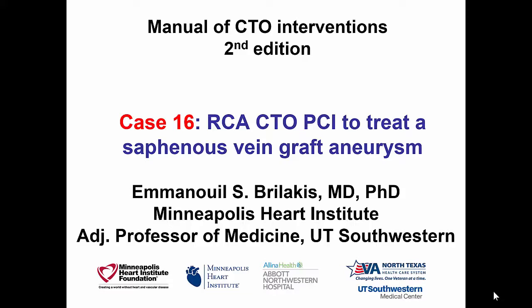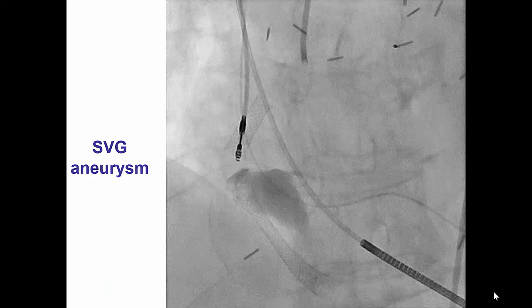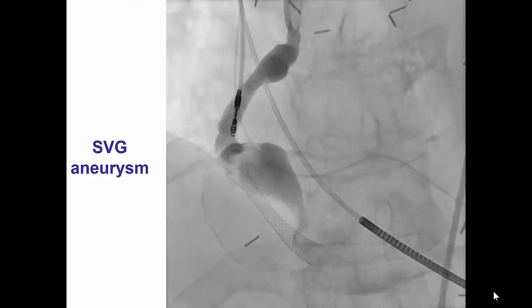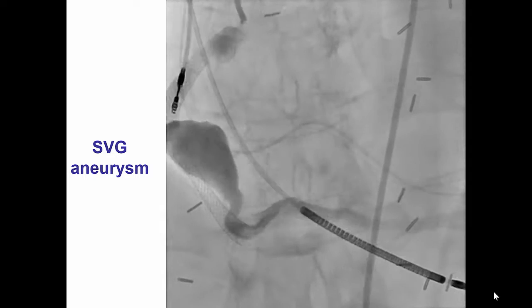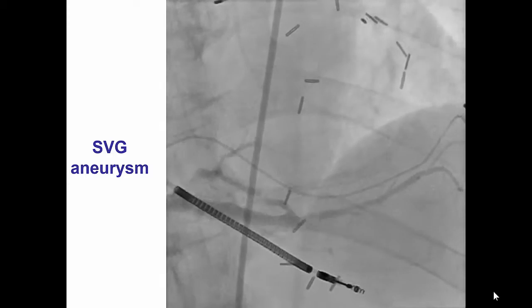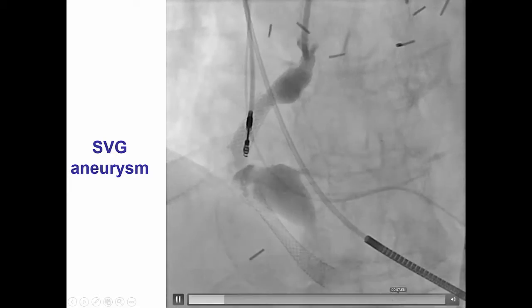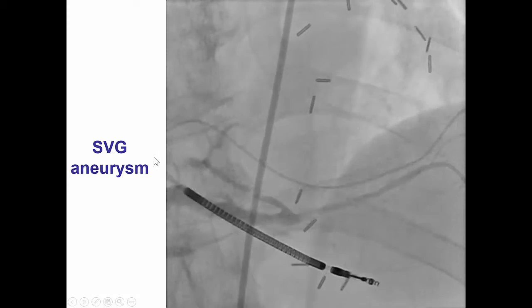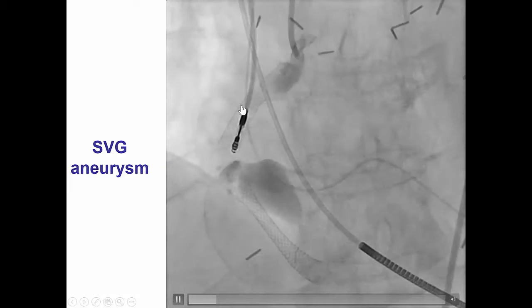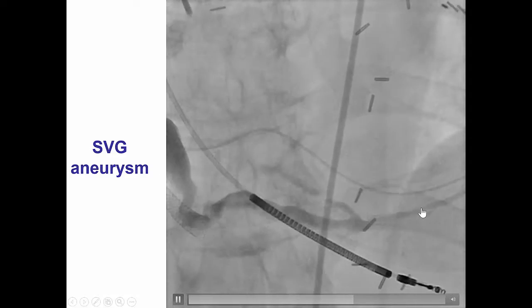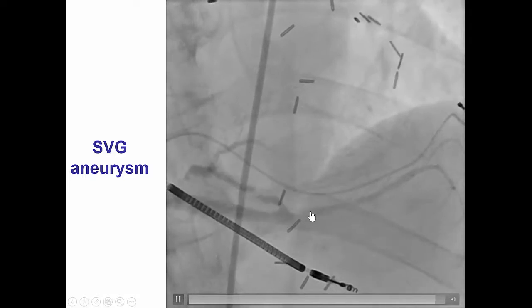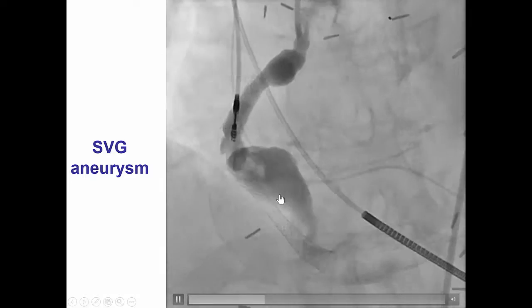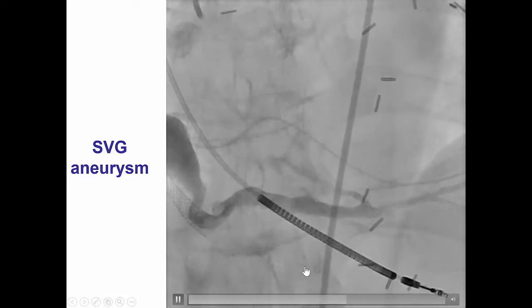This is a patient in whom the native coronary artery CTO was recanalized in order to treat a large saphenous vein graft aneurysm. The patient had coronary bypass graft surgery multiple years before and presented with an expanded saphenous vein graft aneurysm to the right posterior descending artery. There were prior stents placed into this graft, and now there is the aneurysm — flow partially through the stents and partially outside the stents, filling the posterior descending artery. A very complex saphenous vein graft with areas of aneurysm and previous stents.